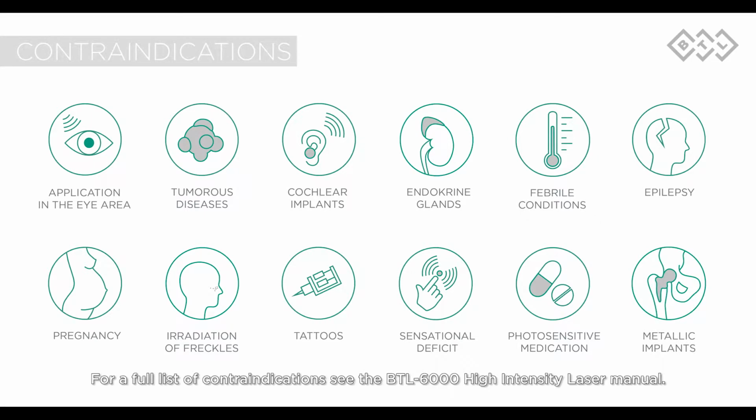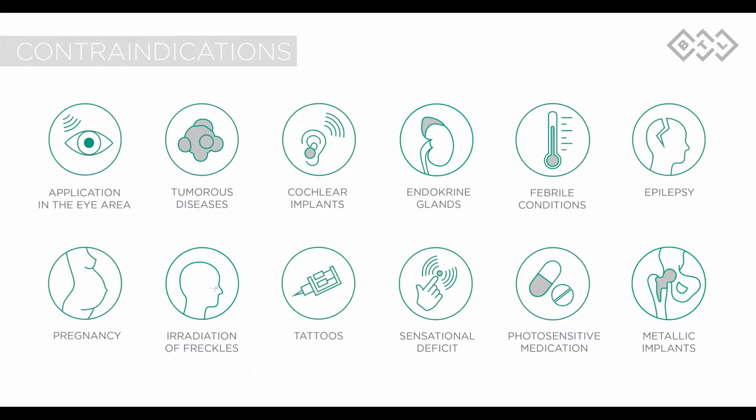For a full list of contraindications, see the BTL 6000 high-intensity laser manual.